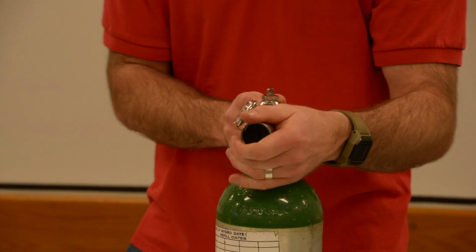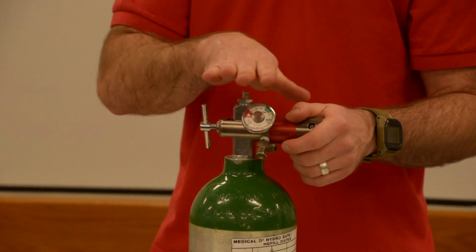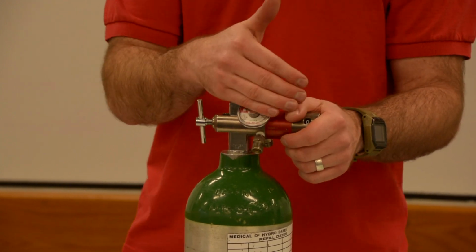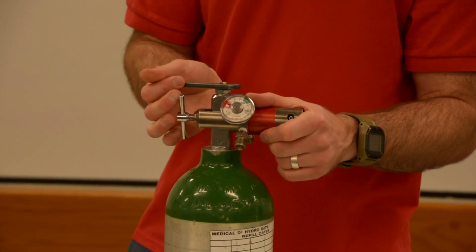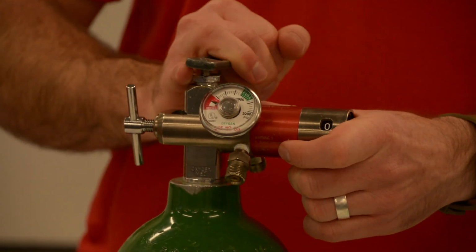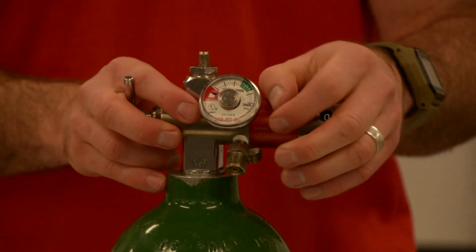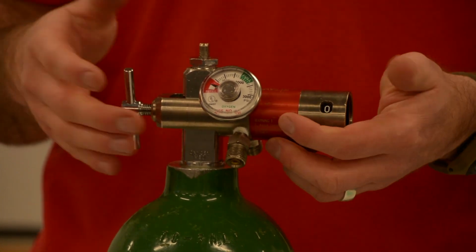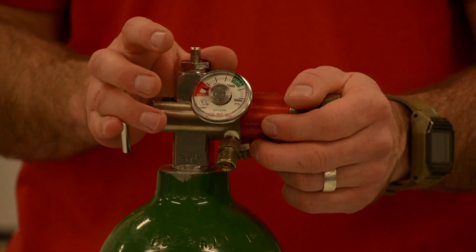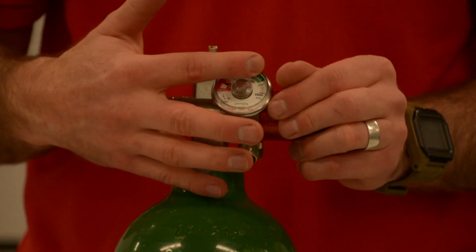Now once my regulator is on my oxygen tank, nice and secure, I'm going to open my oxygen tank and actually charge my regulator. So I'm going to pick up my oxygen tank key and I'm going to open my tank, just 3/4 to 1 turn. That's it. You don't need any more than that. I should be looking for a couple things. Number one, I should be hearing if there's any leaks coming in or out of this tank or this regulator at all. I should also be checking my gauge to make sure that my tank is full.